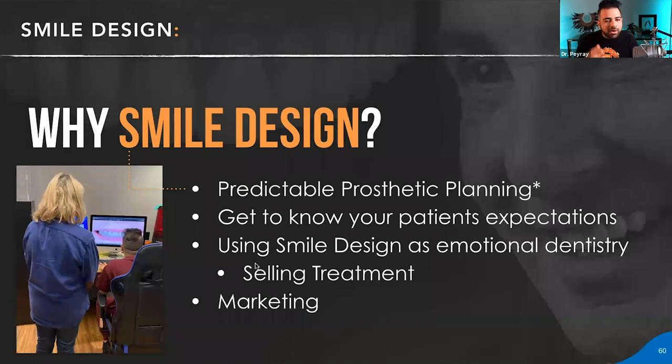and get to know, okay, if this patient was going to get new teeth, where am I going to put the 8 and 9? And I'm going to talk a little bit about smile and show you some cases, but that is one thing clinically, right? Clinically, it helps us to know the prosthetic planning. Getting to know our patient's expectations.